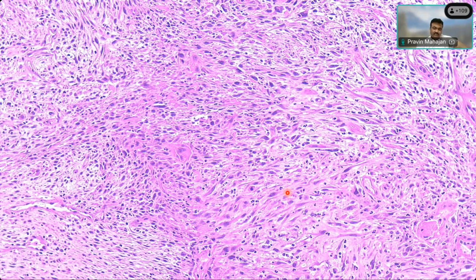Yes, very good. Anything else? What is this that I'm circling? You see this? Mitosis. Yes, correct. It's a mitosis.